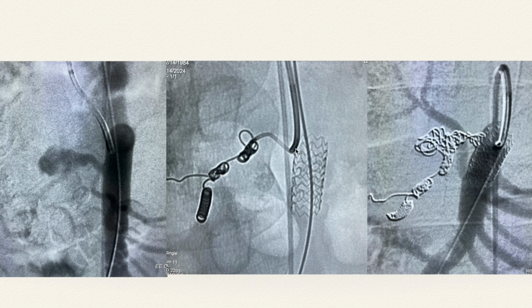The good thing is it will wedge the main catheter and microcatheter, so it won't come out. Another thing is you can coil till the very end, because you have good stability, because the stent is deployed over here. So as you can see, distally the aneurysm is coiled, and even proximally it's coiled very tightly because a stent has been deployed. So this is the case of stent assisted coiling.